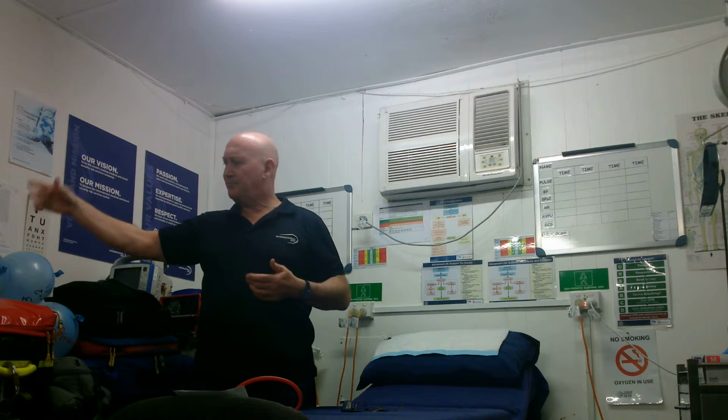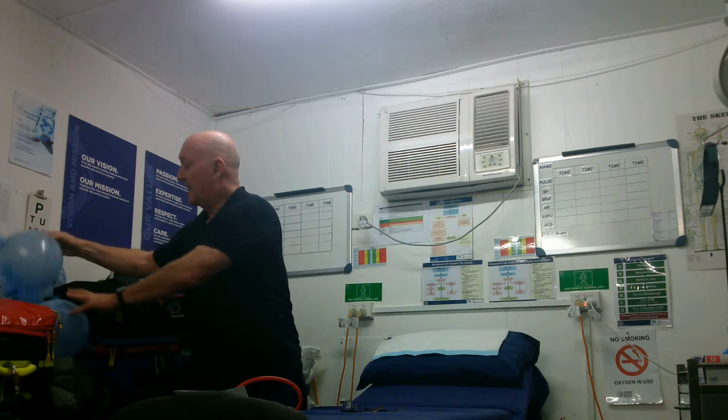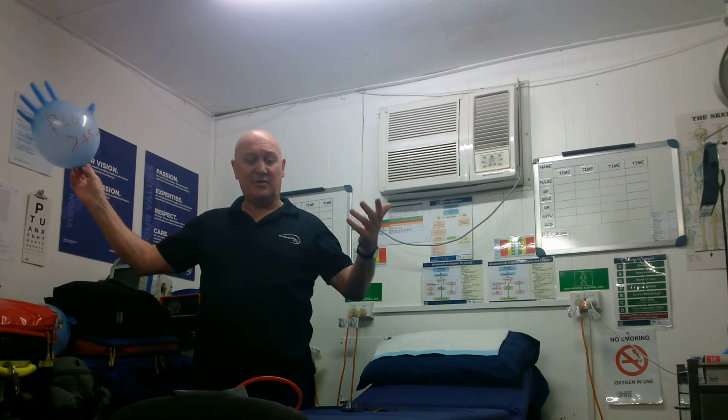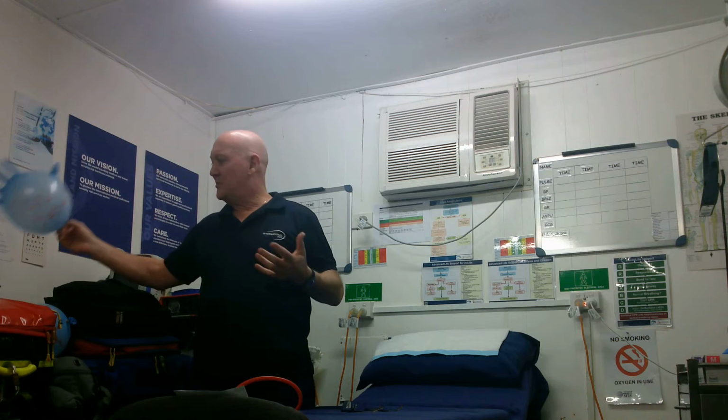You know, we've looked at the patient. Their pH is low, so they're acidotic. And we've worked out that their PCO2 is high, so they're respiratory acidotic. So these things come into play. And then we can adjust our ventilation rate, oxygen therapy, infusion rates for fluids, and drug therapy.